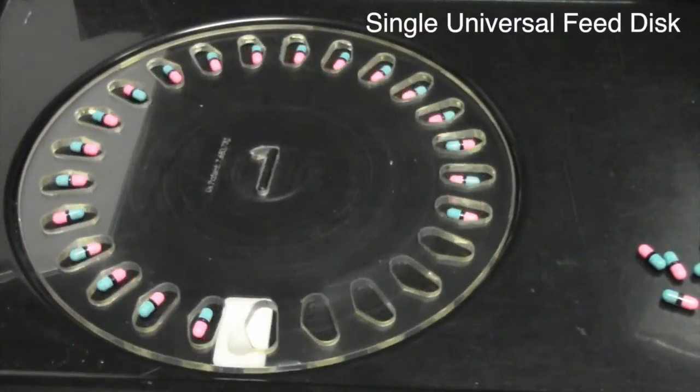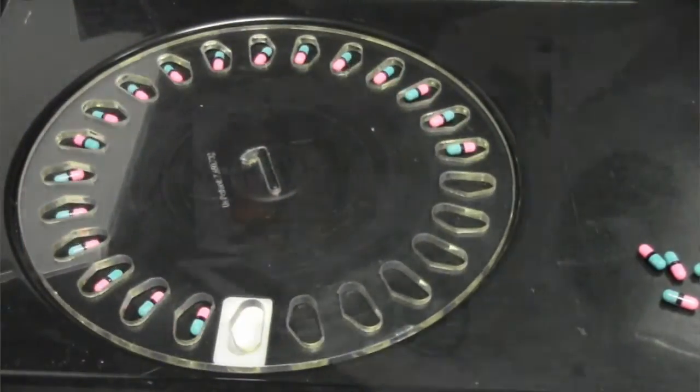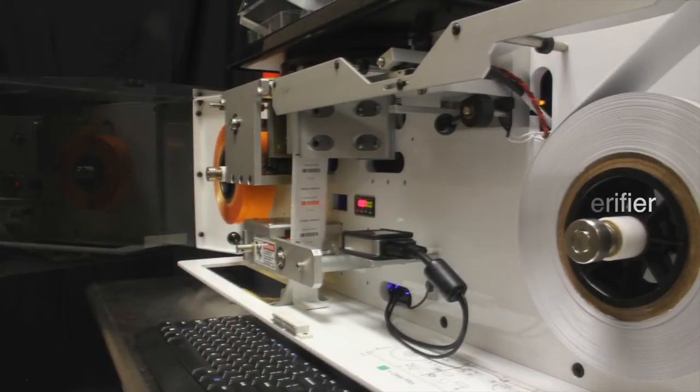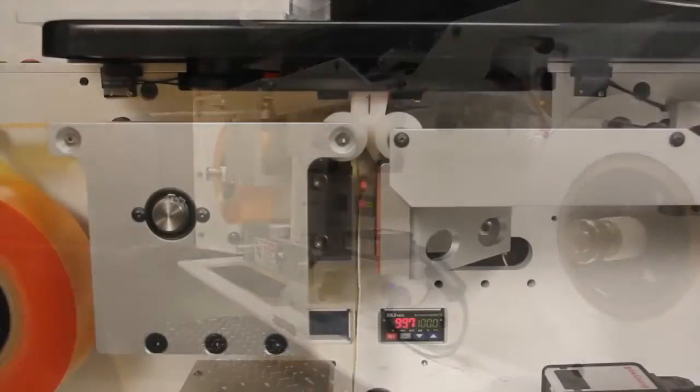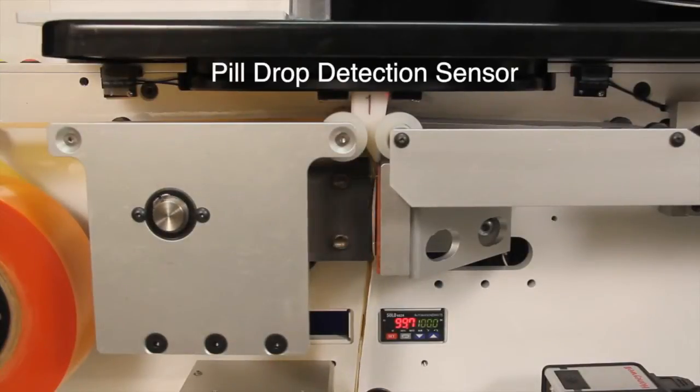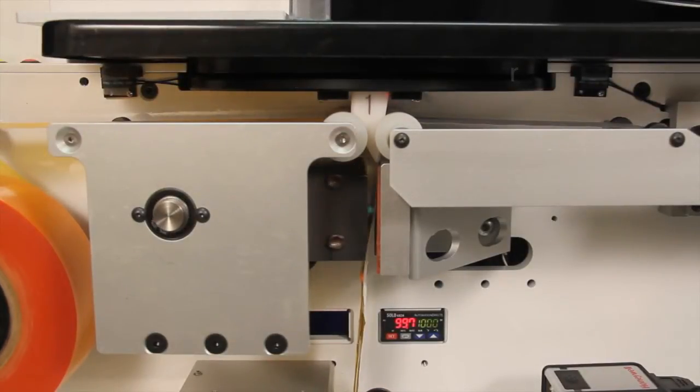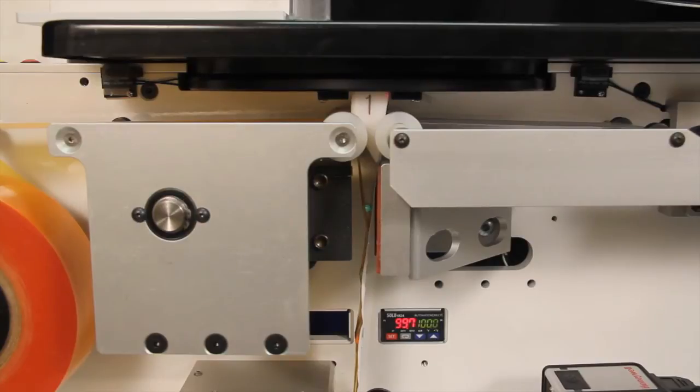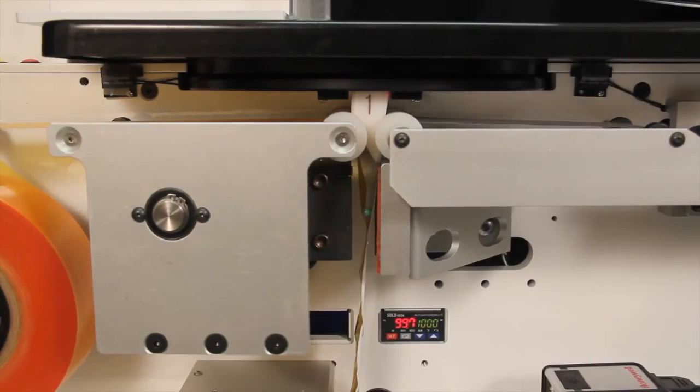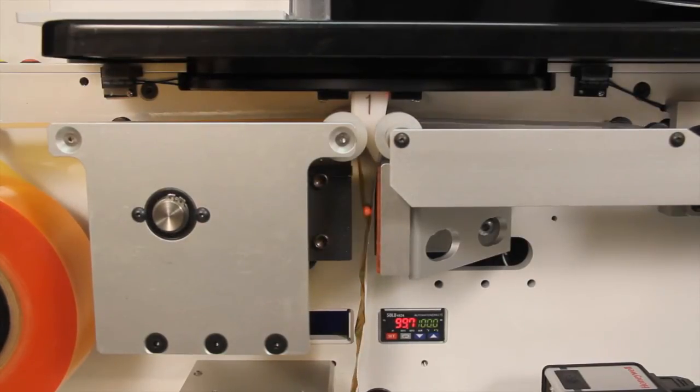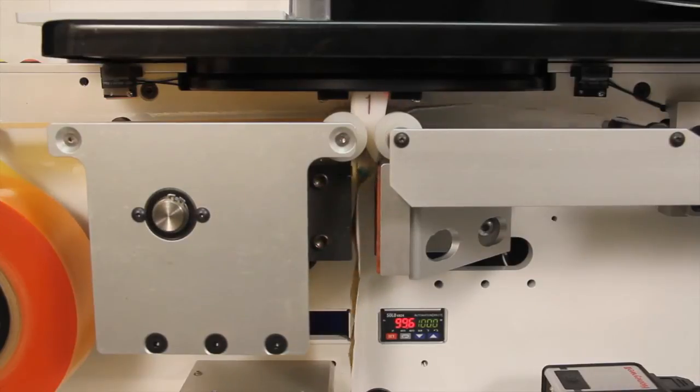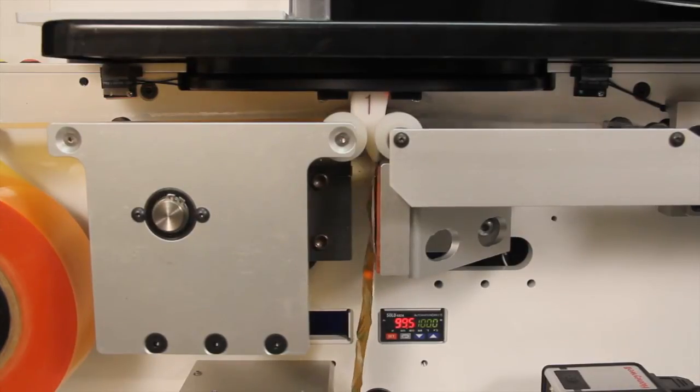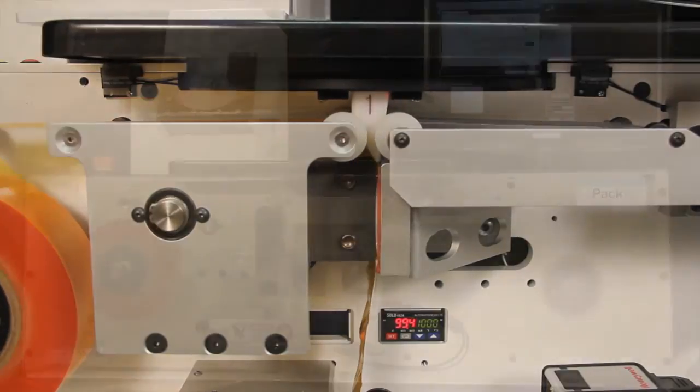The IPAC-RX Packager includes an inline barcode verifier that automatically verifies the barcode on every package during the packaging process. A pill drop detection sensor ensures a pill is in every package and acts as a safeguard should a pill jam ever occur. It also halts the packaging process when there are no pills to be packaged. Our patented universal feed disk eliminates the necessity of multiple feed disks.